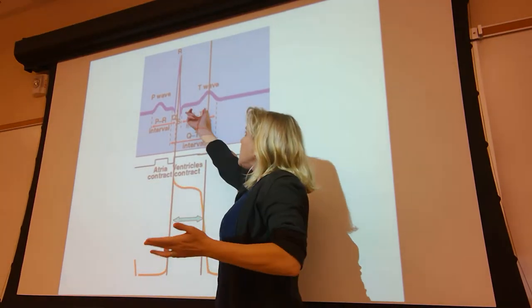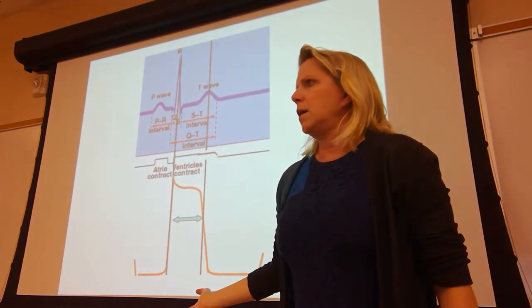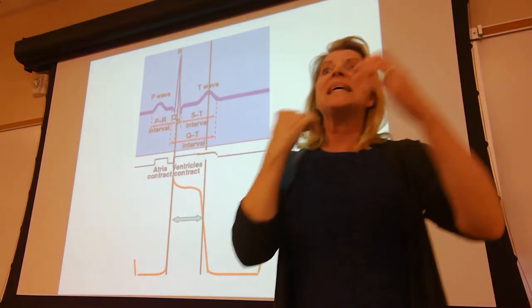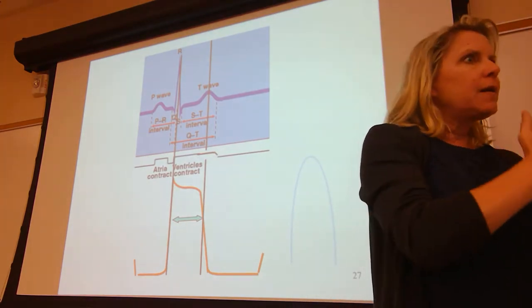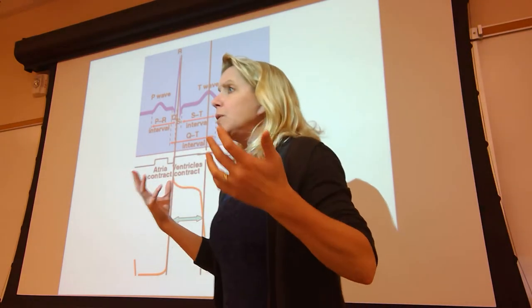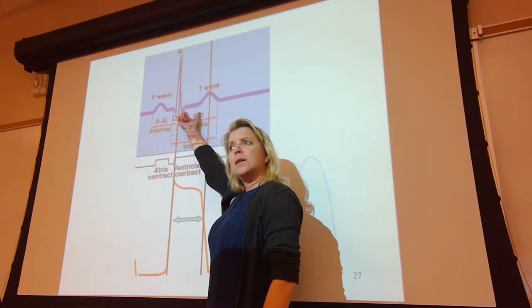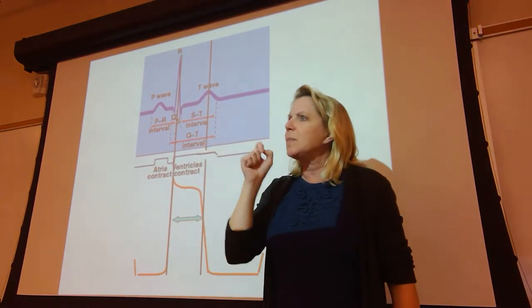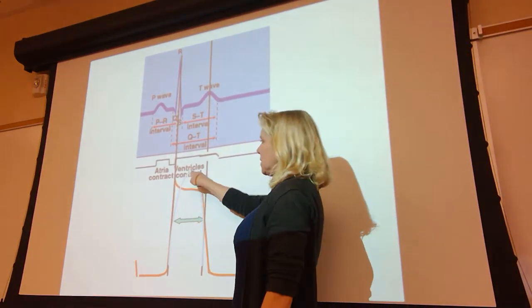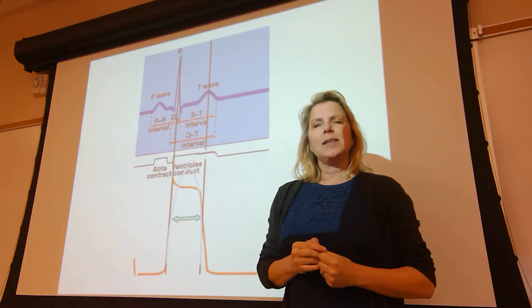When we look at this flat line on the EKG, it's all too easy to say nothing's happening. Nothing's happening electrically because everything is happening mechanically now. Electrical events precede mechanical. The EKG is monitoring electrical events. Those are over with during the ST segment. But contraction is happening now. That's a mechanical event. And in fact, if you actually monitored how much tension was being created, the contractile force would be peaked during the ST segment.